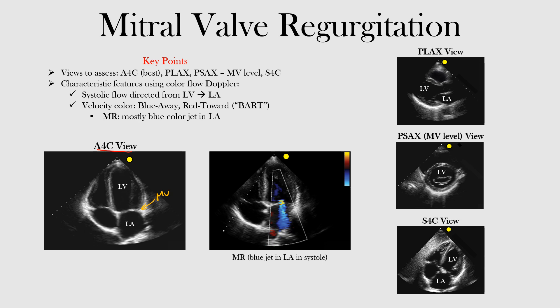Now we're using something called color Doppler — color flow Doppler. We'll go into more detail on how, why, and when we use it in our course, but here we show it can be used in mitral valve regurgitation. We're looking for mitral insufficiency, and what you want to notice is the color jet. The transducer sits at the top of the view, and you can see this color flow going between the left atrium and the left ventricle.